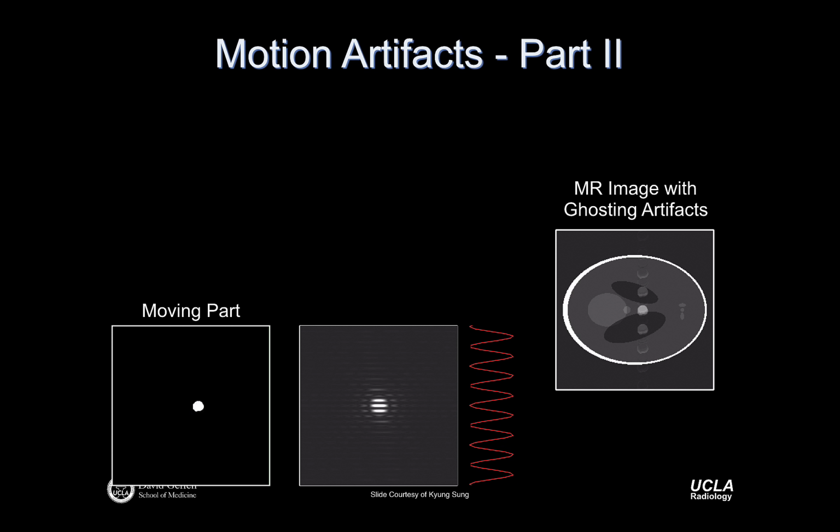So just by swapping phase and frequency, we can shift the artifact to be perpendicular, flips over to this direction, and maybe that's good enough. Sometimes in doing so, because of the specific direction of flow, the artifact can actually get smaller. If the flow was in this direction versus in this direction, sometimes you can minimize or mitigate that specific artifact as well.